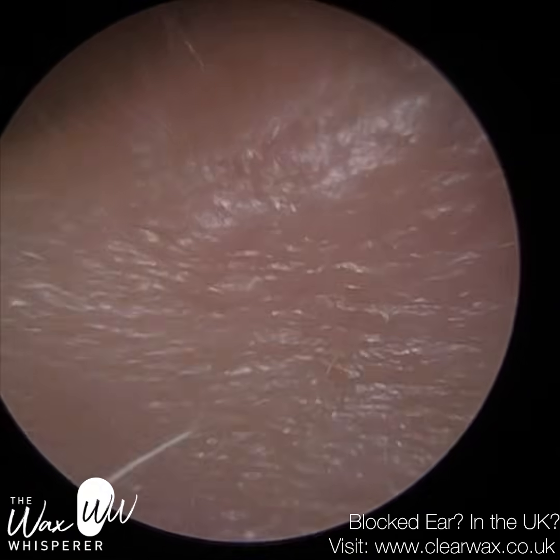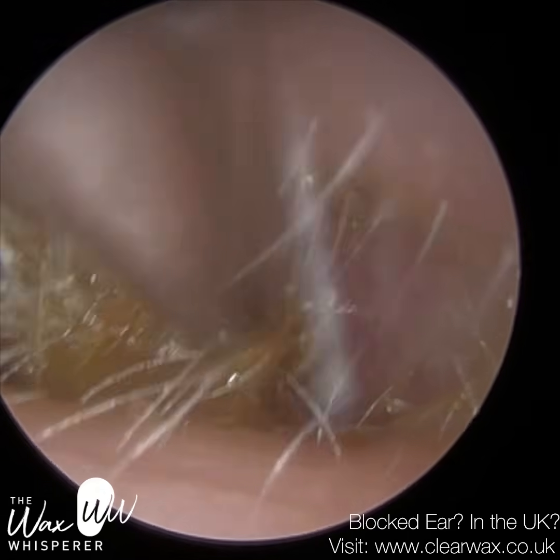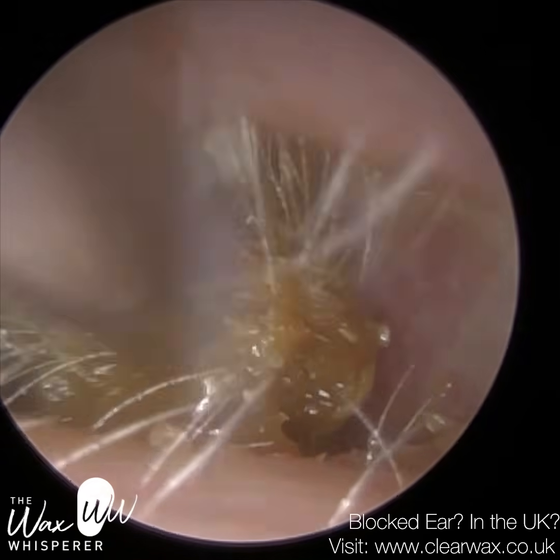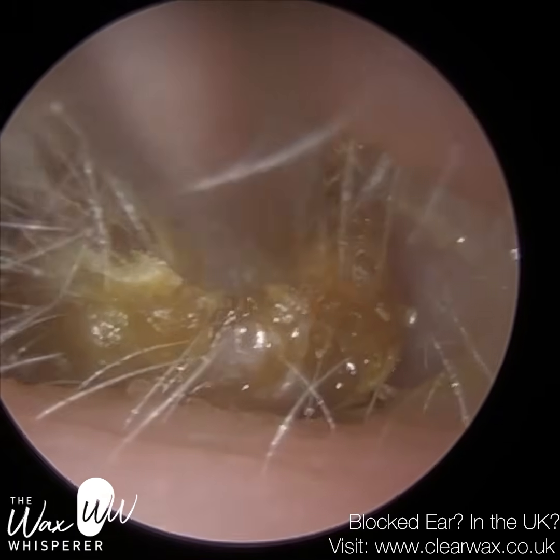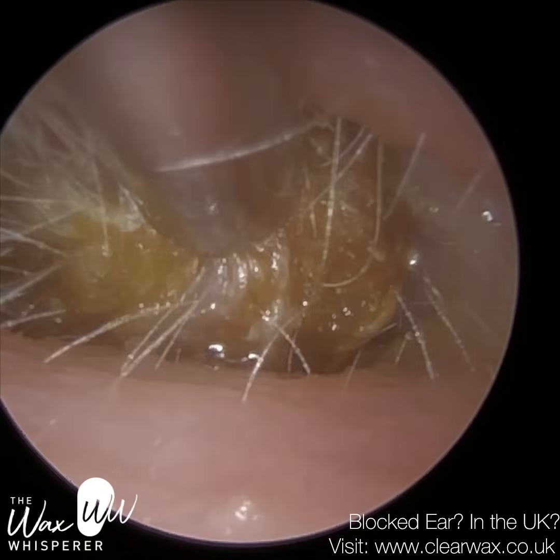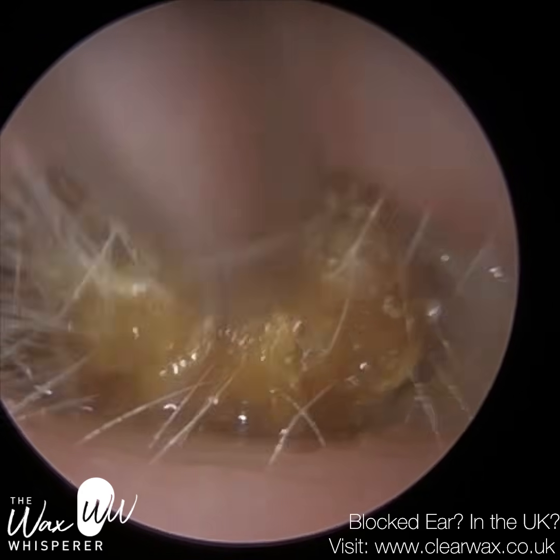There's a bit of inflammation at the entrance. So the ear canal's a bit narrow, so I'm just using the suction probe and the endoscope to stretch the ear open. But as we go into the ear, there's no massive amount of swelling. I think in this ear, the inflammation at the entrance is because the patient was experiencing a lot of itchiness, so they're rubbing the entrance of the ear, hence why the ear canal is slightly swollen there. But inside the ear canal itself, there's no evidence of what we call deep otitis externa. So that's when the dermis layer, the middle layer of the skin that lines the ear canal, or even sometimes the subcutaneous layer, the third layer of skin.